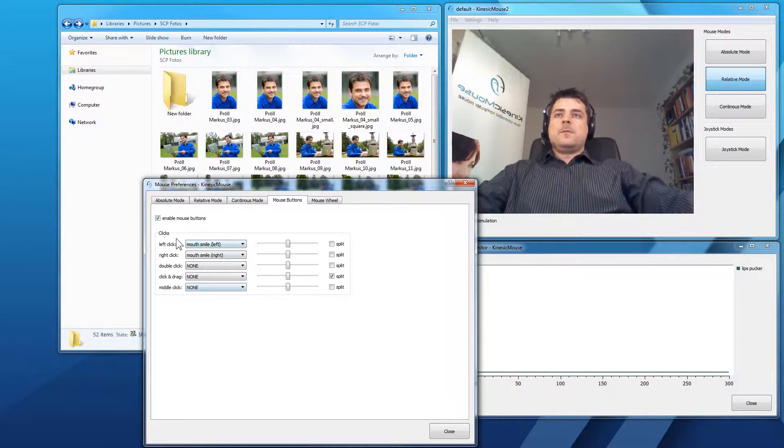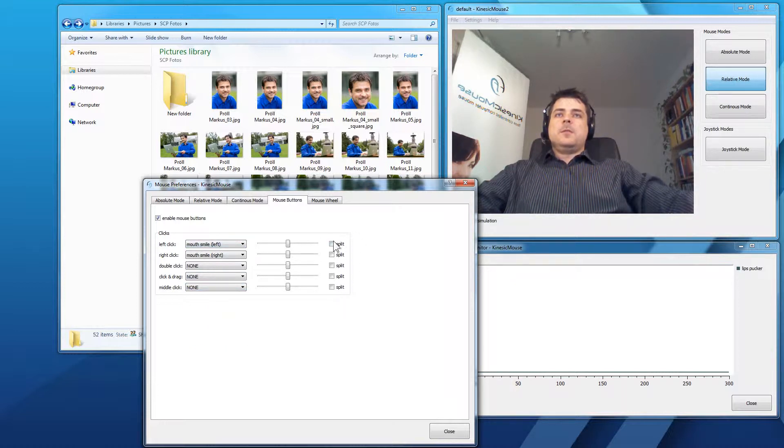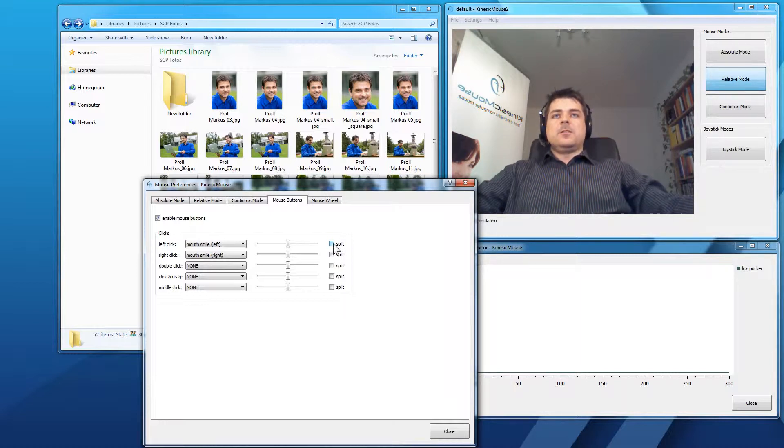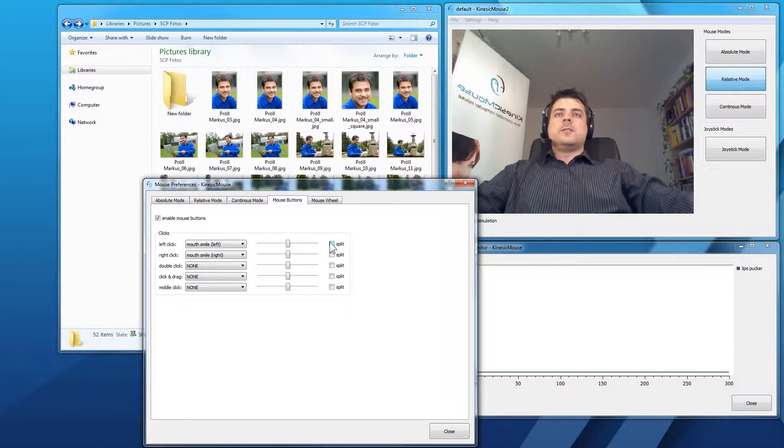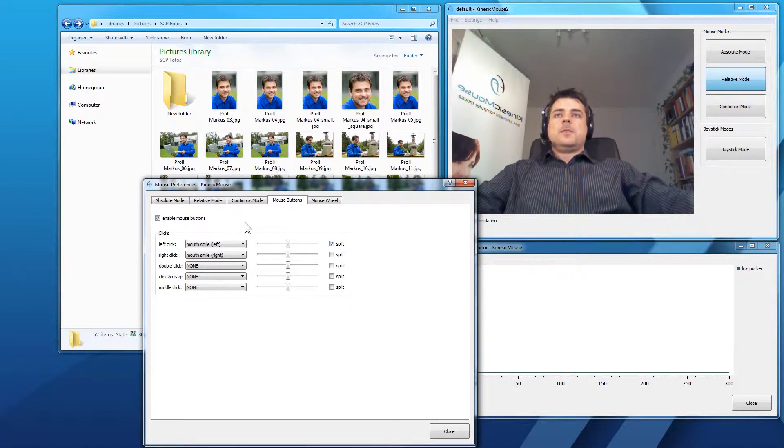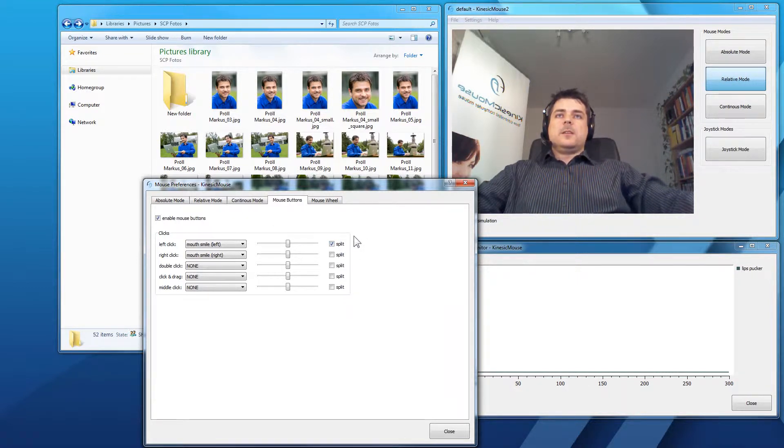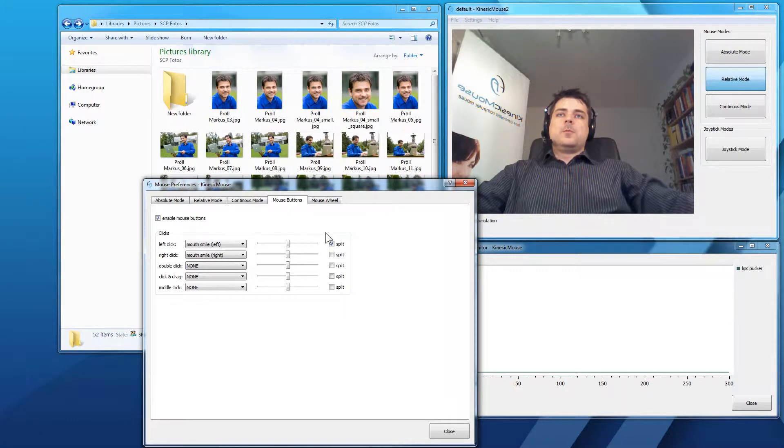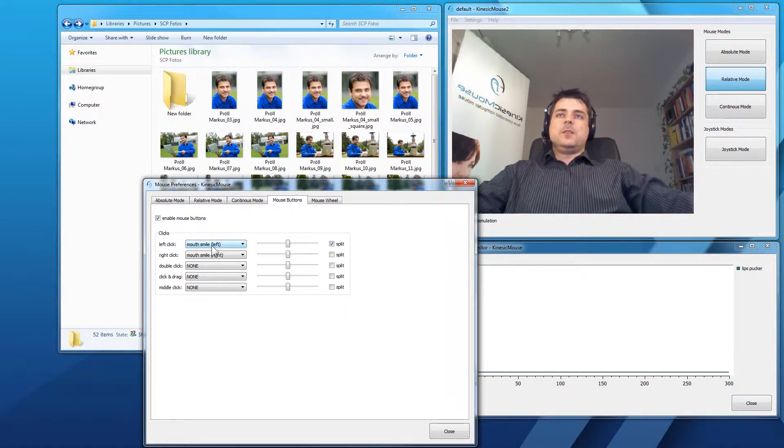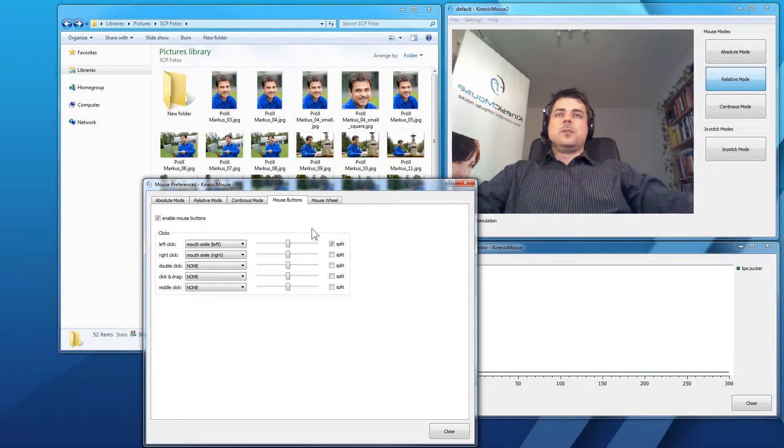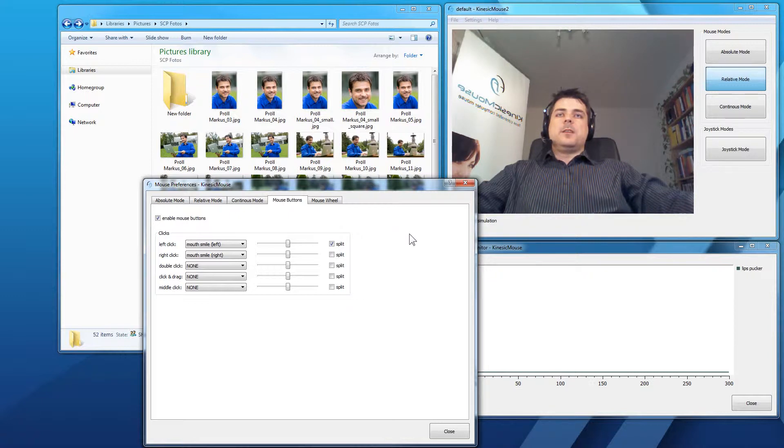We use our left click at the bottom here. And we will also, to perform a click and drag, we also have to set the split function. So, to do a left click, you can now perform the expression. For me, it's mouth smile left. And you can hold this expression and also the mouse button will be held down for clicking and dragging.